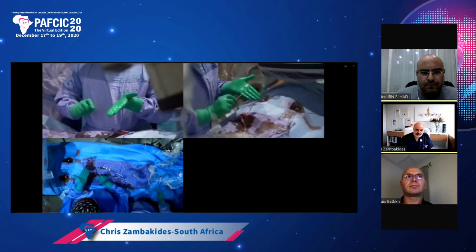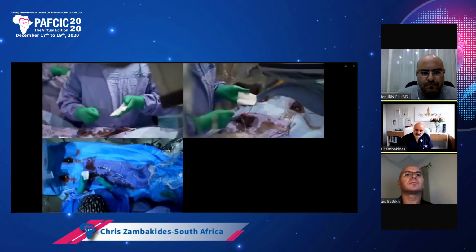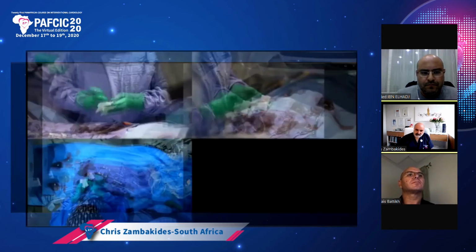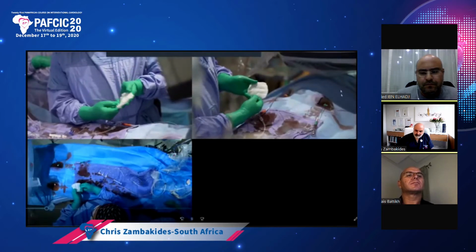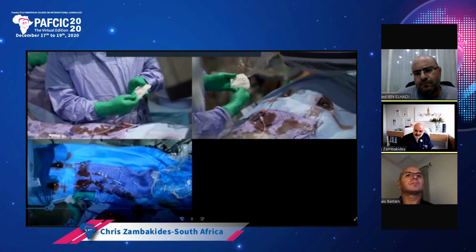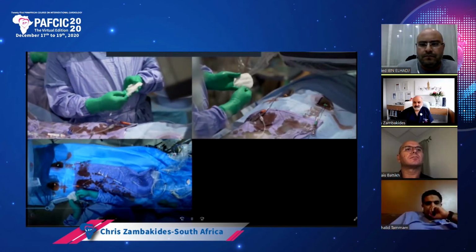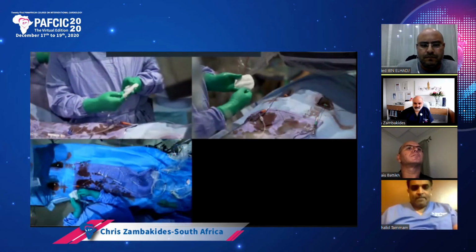So what I normally do is put a very short distal tip, which is only about 1 or 2 millimeters, and then I put a secondary bend which will give me some kind of control to get into the LAD and to get into the septal.